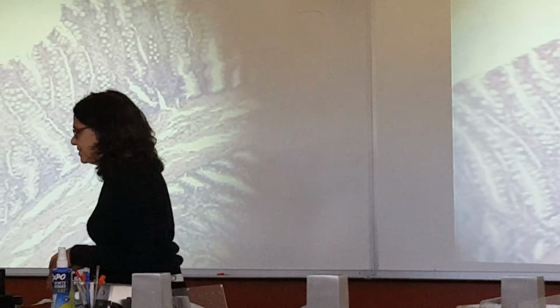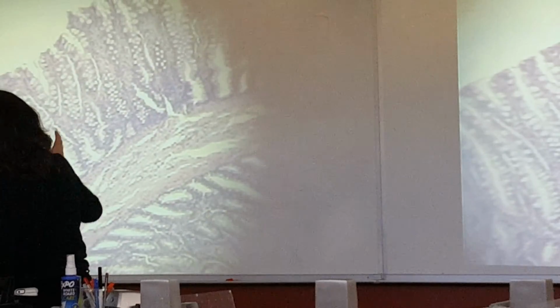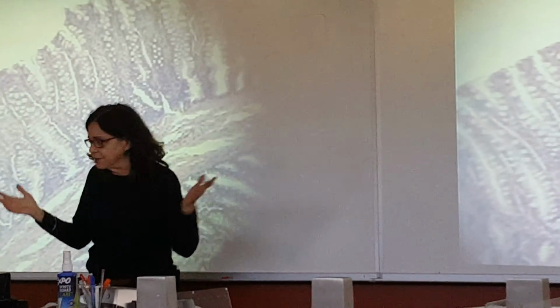Okay. So this is the large intestine, and if you see a slide like that, you see all those goblet cells, then you know. Okay, good.